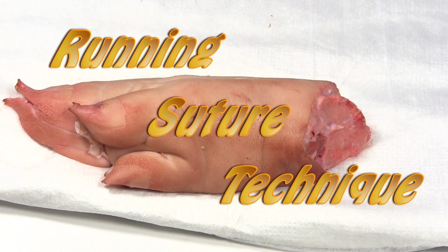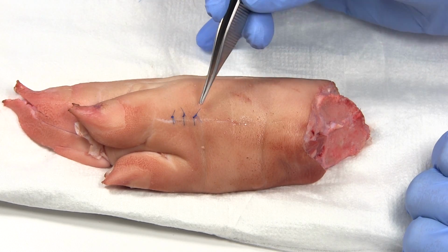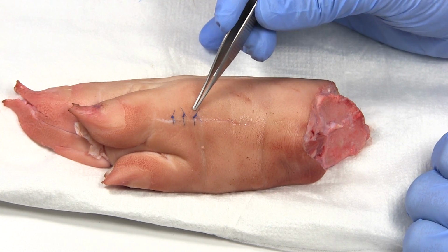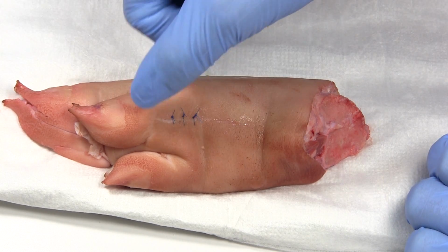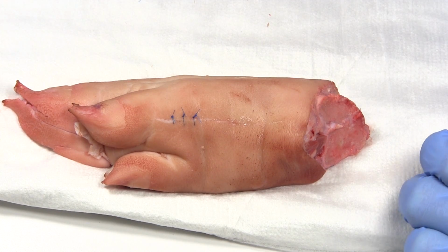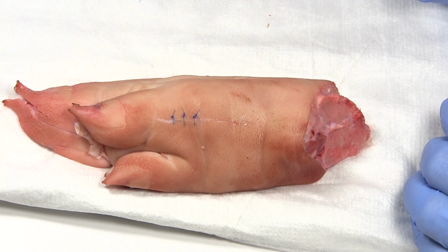All right, quick little video on running sutures. I just did the video on simple interrupted sutures, as you can see here. They work very well, they're very easy. But sometimes if you have a big long laceration or a laceration on the face, it's going to take longer and you can use a running suture.